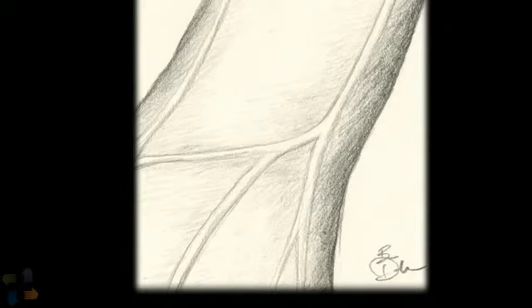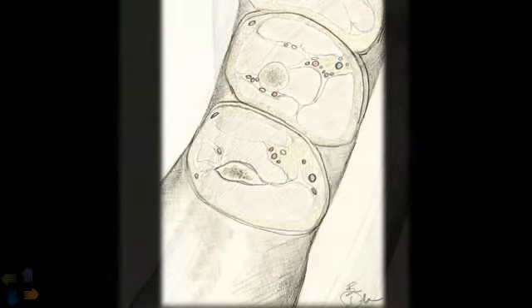There are multiple possible places to start an ultrasound-guided IV, but a good place to begin looking is in the antecubital fossa. An alternative would be the proximal anterior arm along the course of the cephalic and basilic veins. The basilic vein runs with the ulnar and median nerve, so care should be taken not to injure these structures with cannulation. The deep brachial vein runs its course down the middle of the anterior arm and is another site for cannulation, though caution is advised as it runs with the deep brachial artery.